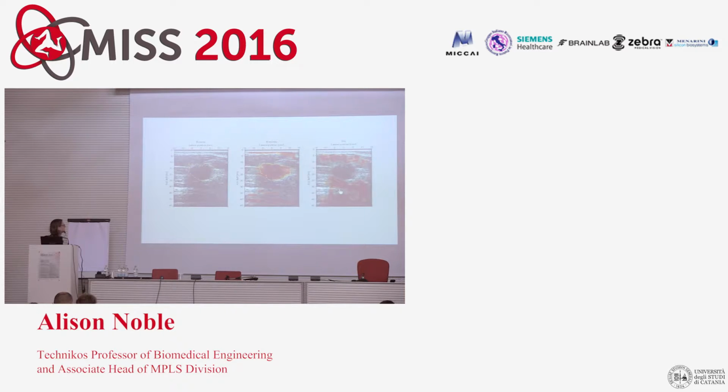So the type of information you'd present is just color-coded here. This is the ultrasound. This drawn on here has been drawn from here. So you've overlaid the area that was stiff on the B mode. The important thing here is to see that the two don't overlap, because they're complementary information. This is telling you about strains. And then you've got this color here showing you whether the object is slipping, or in this case, the middle is not.